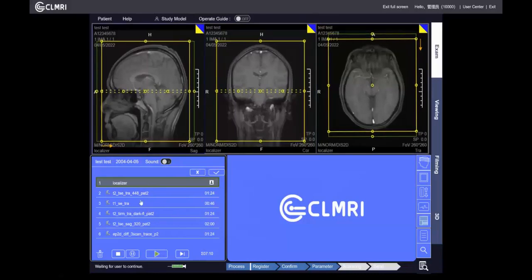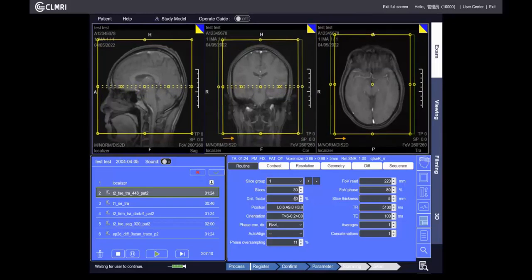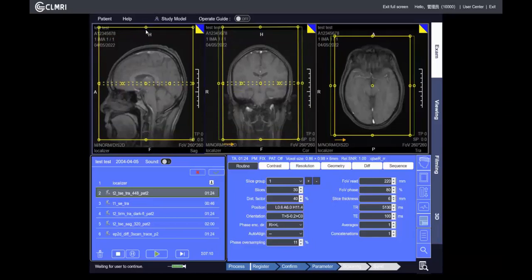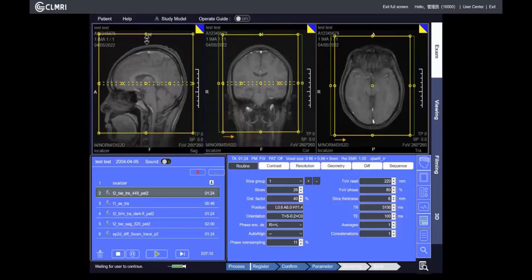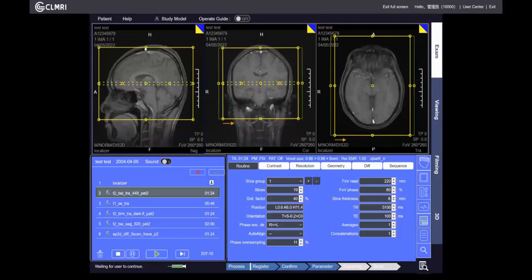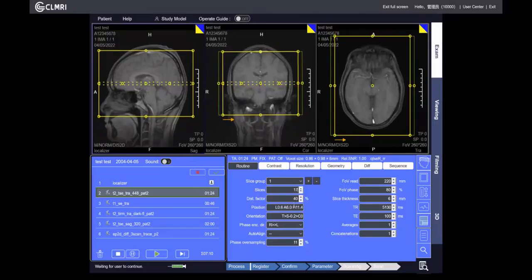It's so noisy — we can turn off the sound. Click the second sequence: T2 transverse plane. We can move the slice group. All the parameters are shown in this area and we can change everything — such as the slice thickness. Now it's 5 millimeters; we can change it to 6 millimeters, which means the scan range is enlarged. We can also move the boundary of the slice group, and change the scan plane, the thickness, and the number of slices.